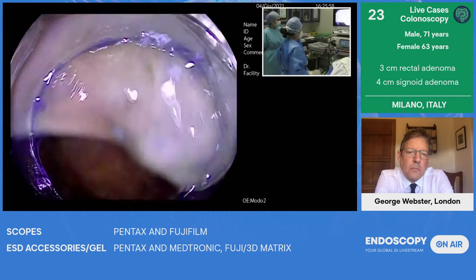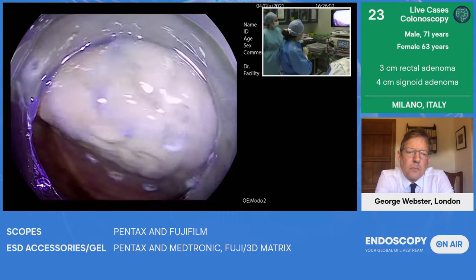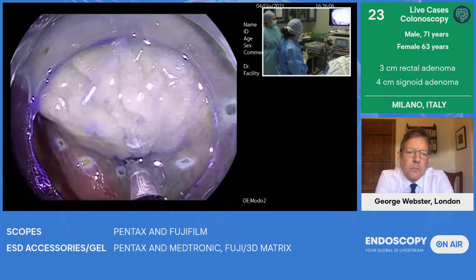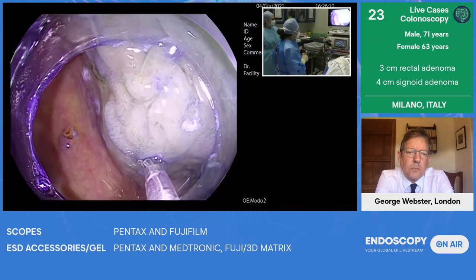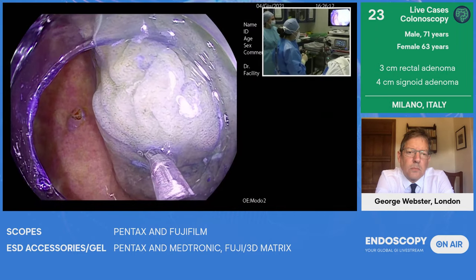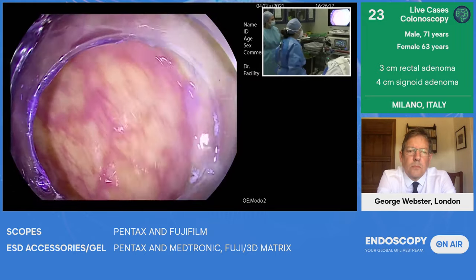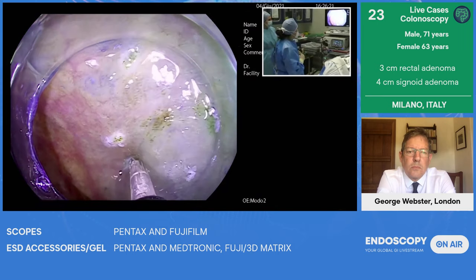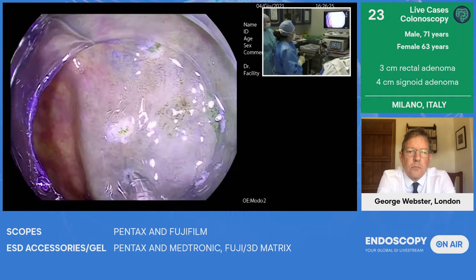Stop. And if you notice, I already marked the lesion because it was very difficult to find. I congratulate the physician that discovered this lesion because it was so flat and difficult to discover. And because we are on IBD, I preferred to mark around the lesion. That is something that in the rectum and in the colon we do only on IBD patients. Usually we don't need to make the marks because the margins are very clear, unless we are in the upper GI.